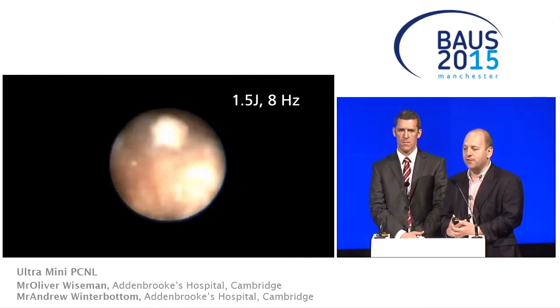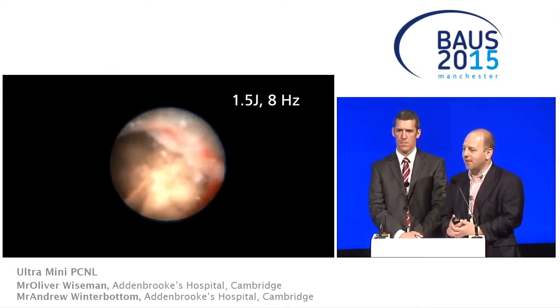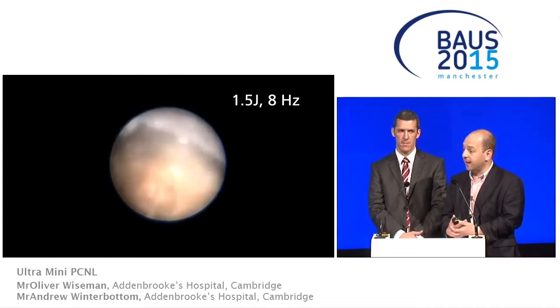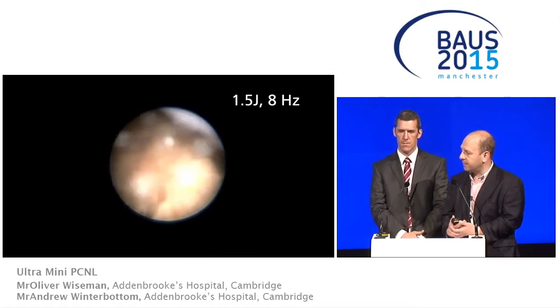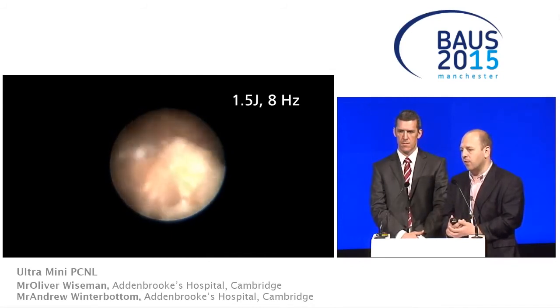So the fragmentation time is 22 minutes. The whole procedure actually took slightly longer at 105 minutes. But this patient went home the next day. We left a ureteric catheter in overnight, which you'll see at the end. So it's probably equal in length to what you would spend at a flexible ureteroscopy.